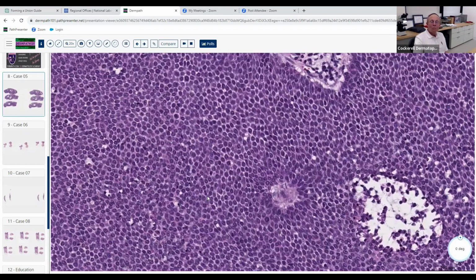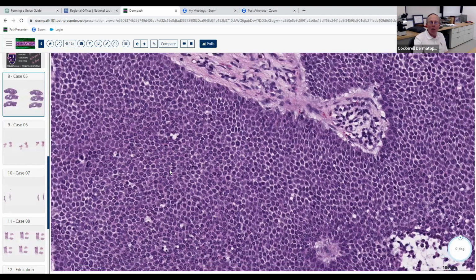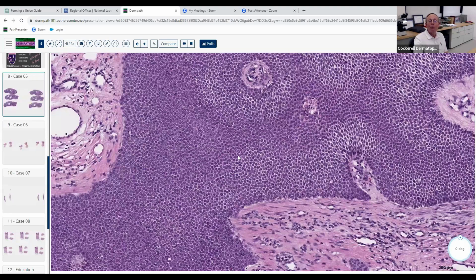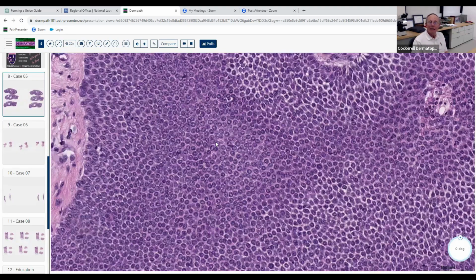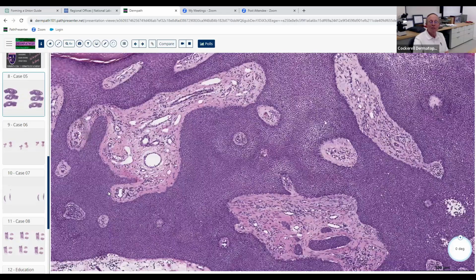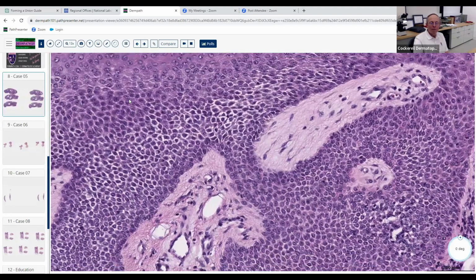Now this is where it gets a little bit more advanced, but you're adding this to your encyclopedia. So what kind of eccrine differentiation gives you sheets of these small cuboidal cells that all look alike, pretty much? What do we call that? Well differentiated. Well, it is well differentiated, but there's a specific name for the type of differentiation that we're looking at right here. Sometimes things are named after a disease state, like psoriasiform named after psoriasis, lichenoid named after lichen planus. Sometimes this is named after probably the entity, but it's kind of a weird name that was originally described.